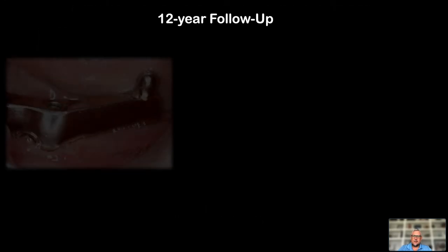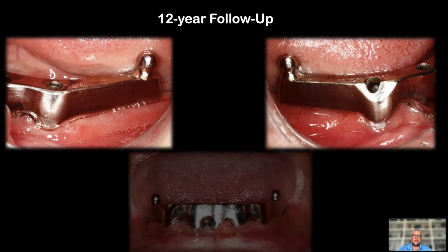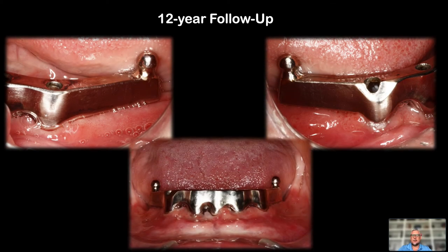And when we start talking about a little bit of background and we talk about restoring a completely edentulous arch, we know there are a lot of treatment options out there. And one preferred treatment option is the implant bar.